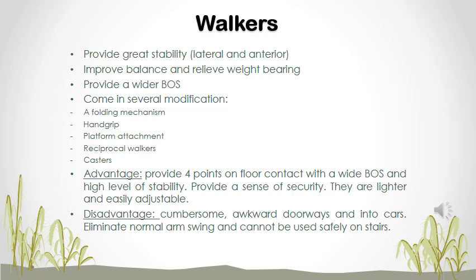Advantage of using a walker or issuing a walker for your patient is that it provides 4 points on the floor and thus a wider base of support and stability. It also provides a sense of security.